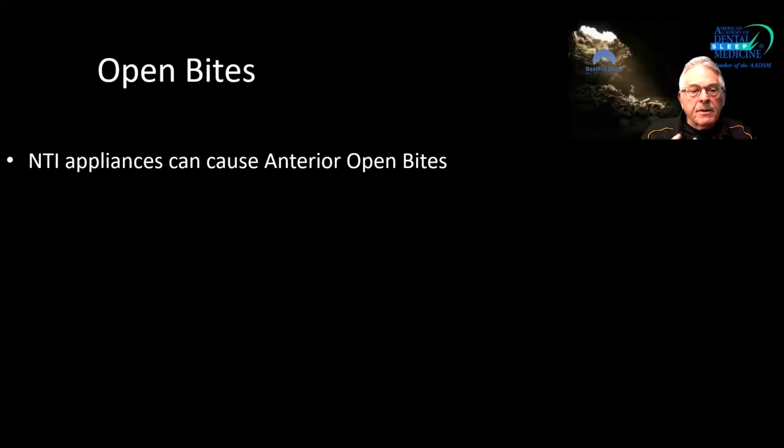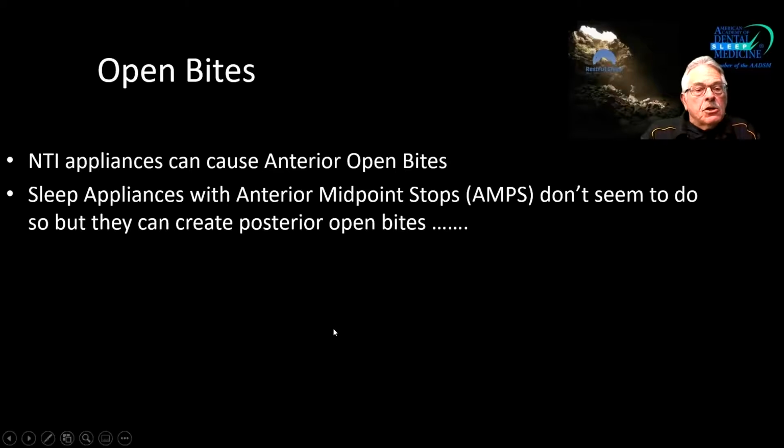And we're going to discuss that a little bit here so that we can understand how an anterior midpoint stop might or might not be an appropriate thing to do for a sleep appliance. Obviously, I happen to think it's very appropriate. That's all I do. So a sleep appliance with anterior midpoint stops, they don't seem to create anterior open bites.